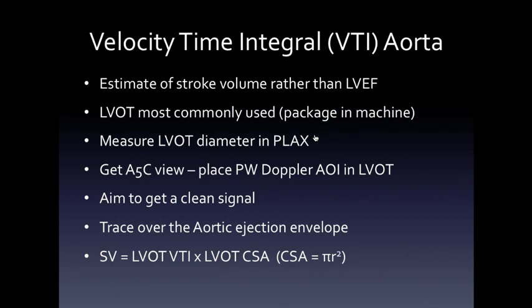The way you're meant to do it is get a nice left ventricular outflow tract tracing, measure the left ventricular outflow tract diameter, and from that diameter you're going to get a radius through which the blood is ejected. So if you know the radius and you have the velocity time integral, you can calculate the stroke volume with a very simple equation. Now actually calculating the VTI is based on integration, remember from your mathematics, which thank goodness nowadays is done by computer. To do it manually is tricky. So very simple mathematical assumptions. And this is really what it looks like.